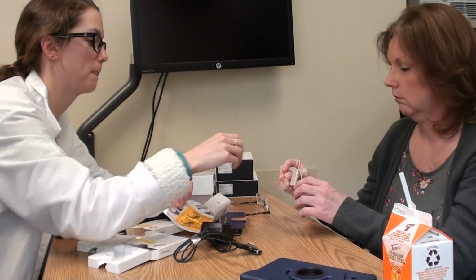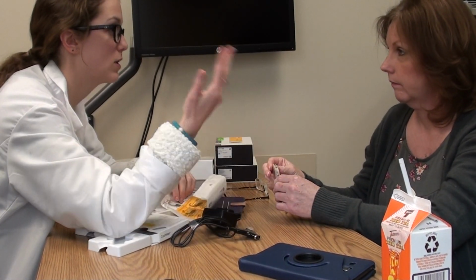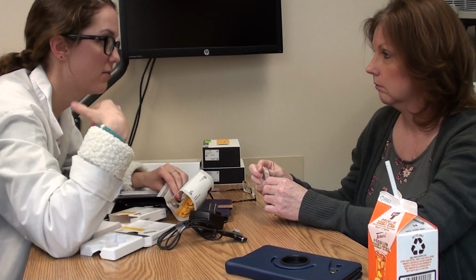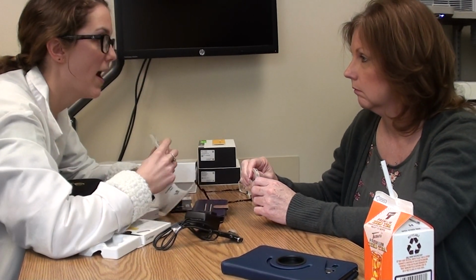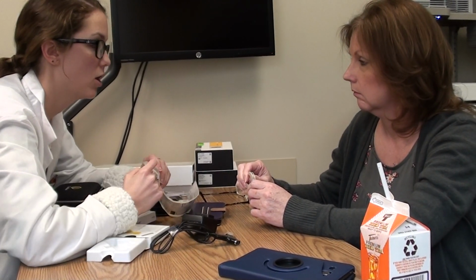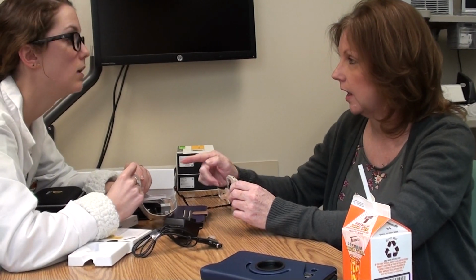These are your microphones. So that's what's picking up the sound. So those can get clogged with dust or debris. You have mic covers, so if you need to change your microphone covers, you have extras. Oh, okay, like when they get dirty, like changing them, okay.